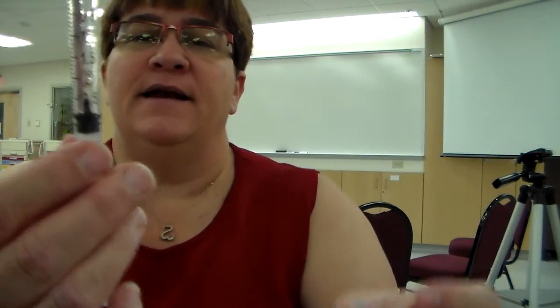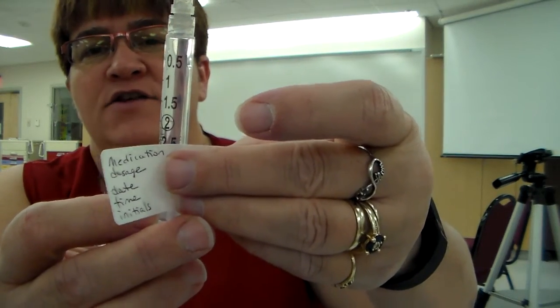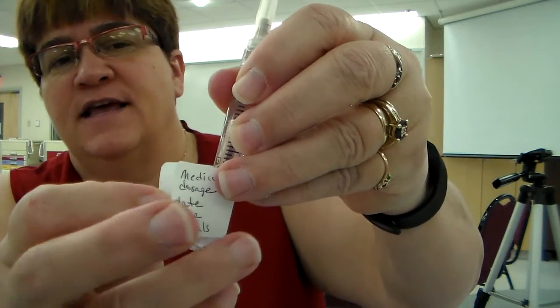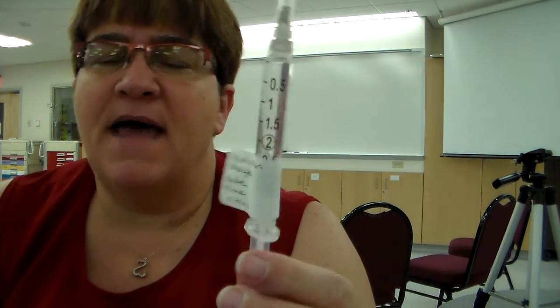And you want to put it on, okay? You want to put it on as far down as you can here, okay? And you just feed it onto itself. Just like this, all right? There you go, okay? Now, I've covered up my medicine.